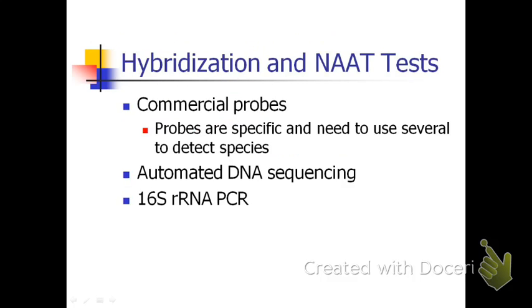Hybridization and the NAAT test. So, it's a commercial probe. This one is no longer for phenotypic characterization, but for genotypic characterization. And this is not being done routinely, usually for research purposes.